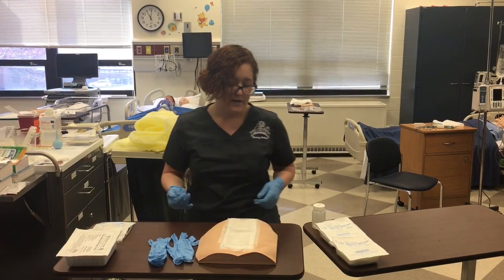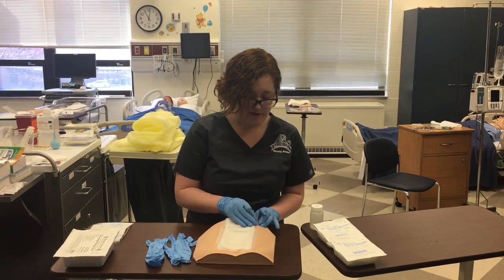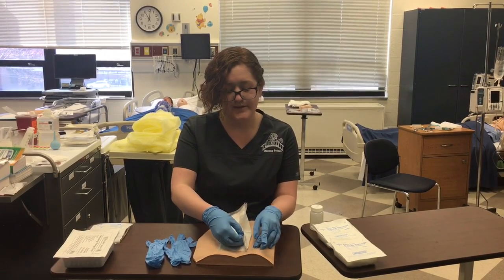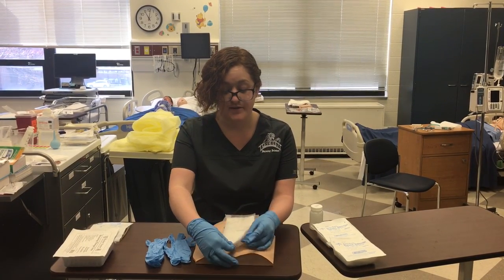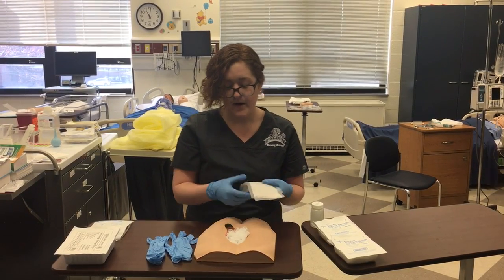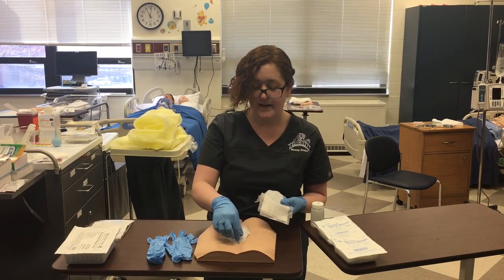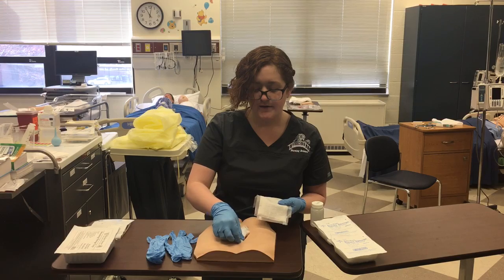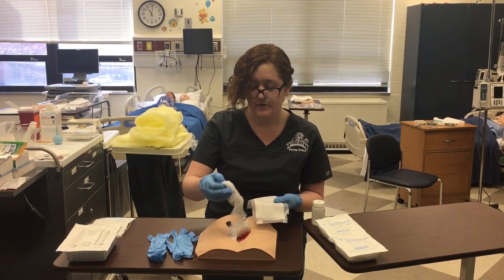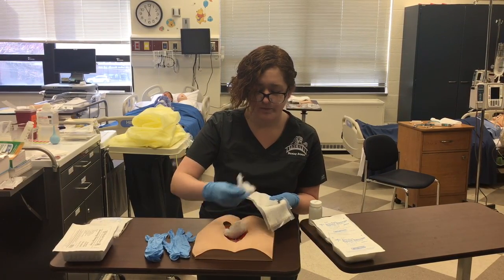Alright, now I am going to remove the dressing, kind of pulling it away from the skin, pushing on the skin to help remove the dressing better, making sure that I'm not damaging the skin as I'm removing it. Okay. Then I'm going to remove the gauze packing from top to bottom and from side to side. If there is any resistance with it, if it's sticking to the wound, I can apply some sterile solution to help moisten it and make it easier to remove.